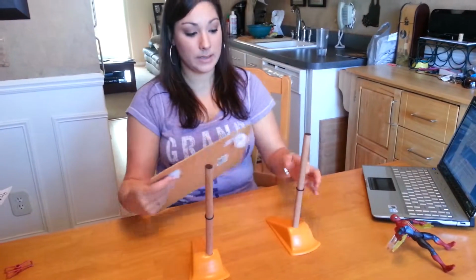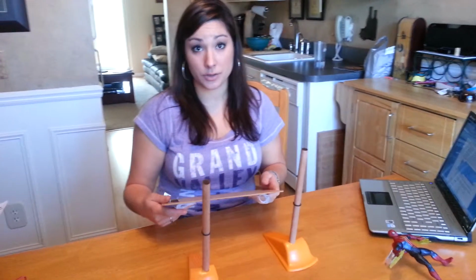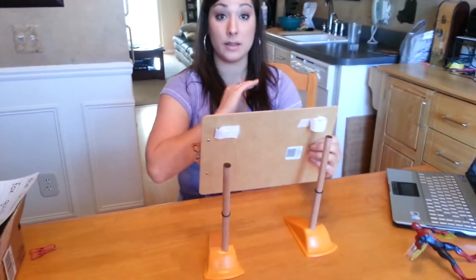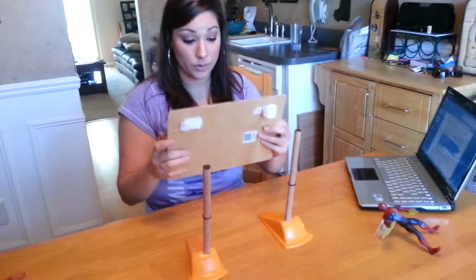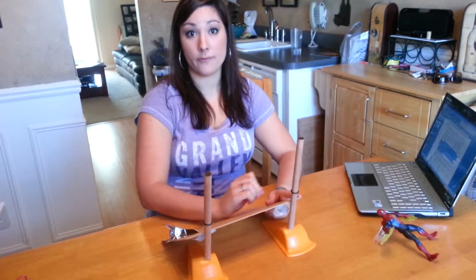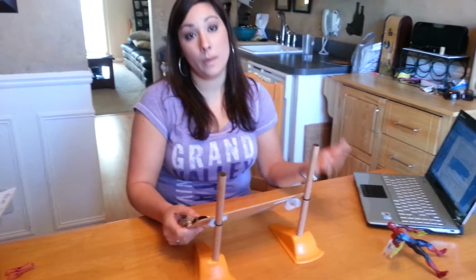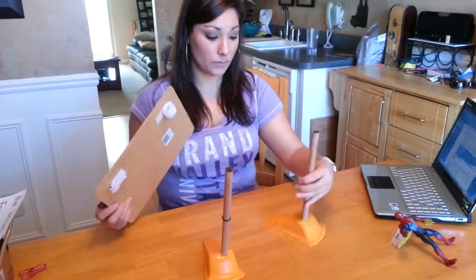So the slant board is used for kids with visual perceptual issues or postural issues, so they can put things in the line of their vision. You can bring it closer, further away, or even with handwriting to make it easier if you have fine motor issues or upper extremity things. So it makes it a little more accessible for the kid during school to be able to read and write.